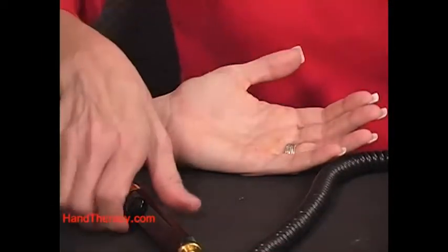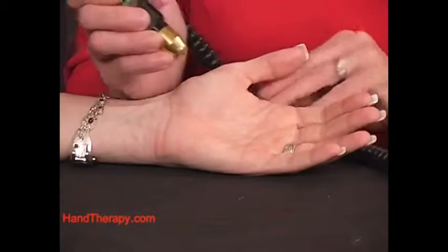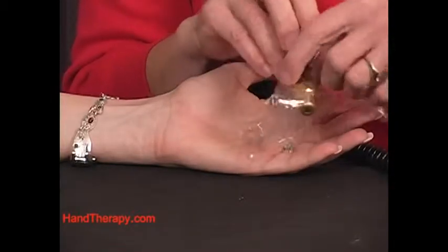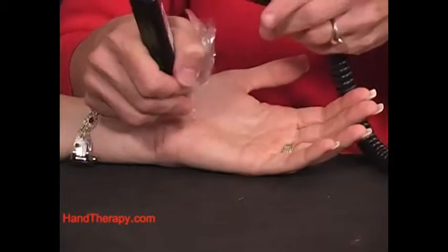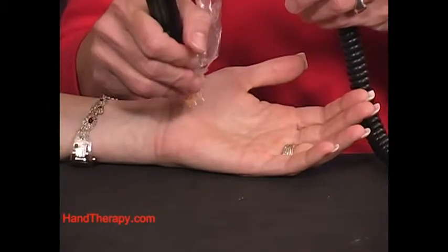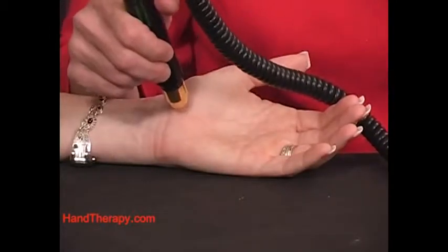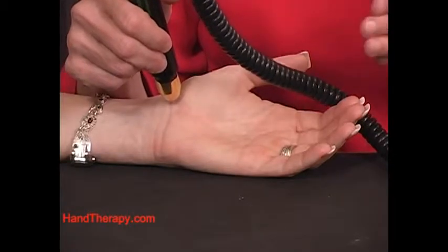Now sometimes in wounds, if there's no skin, then you would want to put like a cellophane. You can use just your cling wrap from your kitchen. Put the cellophane over the laser, and then you can treat, okay? Or you can even take the laser and have it hovering over the wound and not having direct contact. Just remember, when you do that, you're going to lose some of the light.